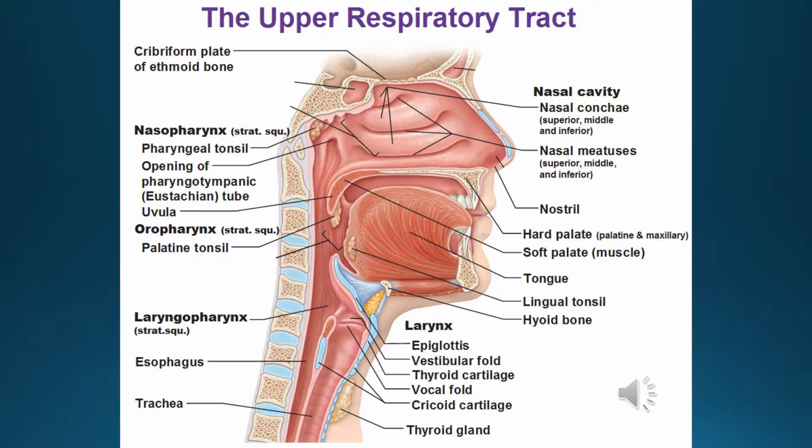If you use a Miller blade or a straight blade, you want to actually identify the epiglottis and lift it up directly. The other approach in the vallecula is an indirect lifting, but both should expose the vocal cords. The vocal cords will appear white, and you should also be able to identify the more pink esophagus opening. Usually you can see the esophagus first, and as you lift up, then the vocal cords will come into view, and that's where you do the direct visual intubation.